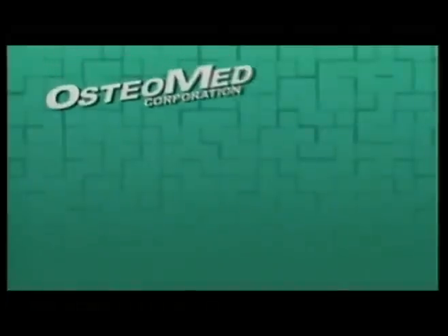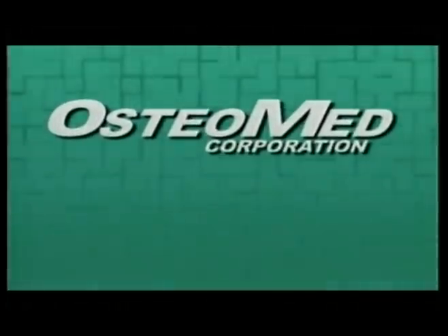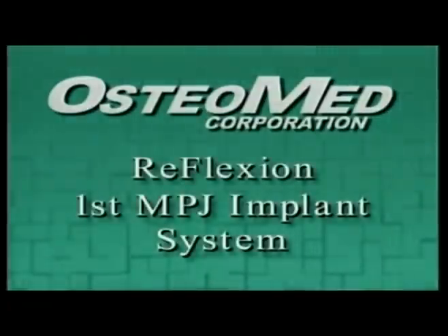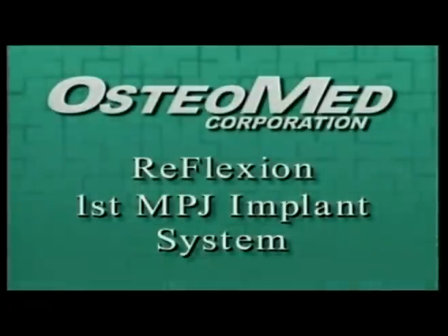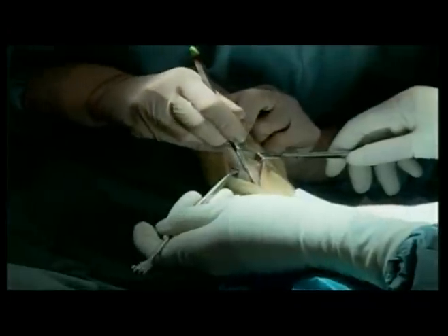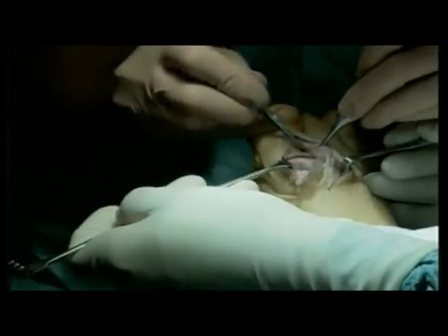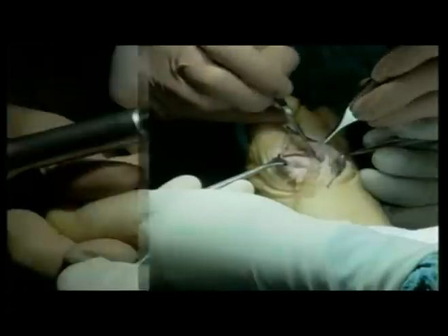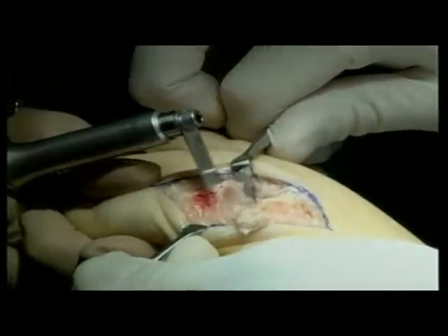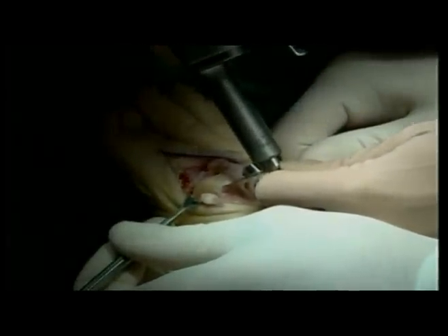Welcome to Osteomed. This training video is designed to provide guidelines on how and when to use the Osteomed Reflection First MPJ implant system in surgery. The system is indicated for reconstruction of severely disabled and/or painful metatarsal phalangeal joints resulting from osteoarthritis, rheumatoid arthritis, traumatic arthritis, or failure of prior arthroplasty.